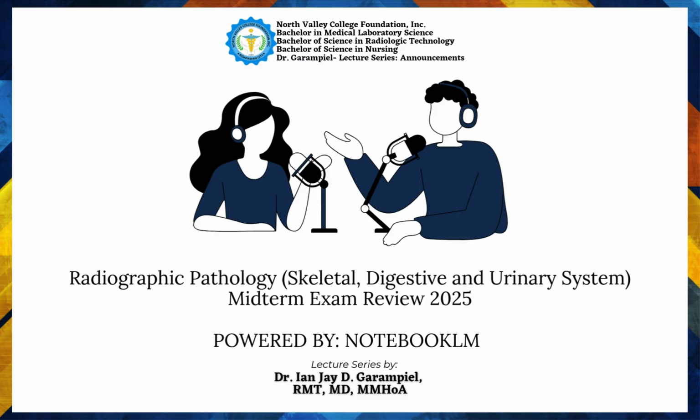We also have 2 pediatric diagnostic signs that are truly iconic. First, the 3-week-old infant with projectile vomiting and a palpable mass. Ah, yes, that's pyloric stenosis. The physical finding is often described classically as a mobile hard olive in the upper abdomen. An olive. Yeah, that's the description. And the ultrasound confirms it by showing a markedly thickened pyloric muscle, typically thicker than 3 millimeters. That olive sign is pretty much a dead giveaway.